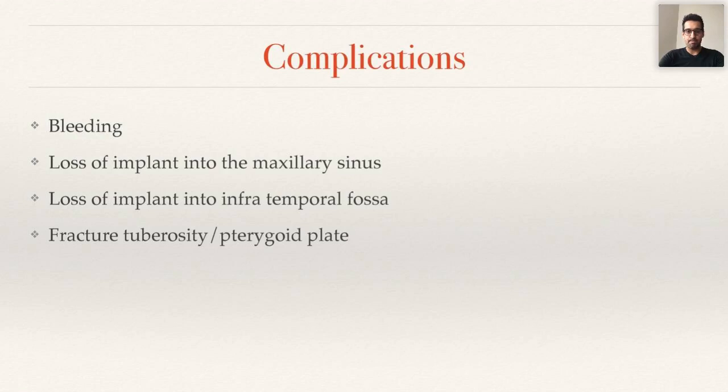But that's the big worry when you do these pterygoid implants, that there's a risk of pushing the implant into the infratemporal fossa, and that really is serious stuff, because getting that out is not going to be easy, and it's probably going to be a referral to Maxfax. So I really push home using an implant system that allows you to use a carrier for safety. If you feel you're losing the implant, if you've lost stability, you've got something to grab onto to pull the implant out.